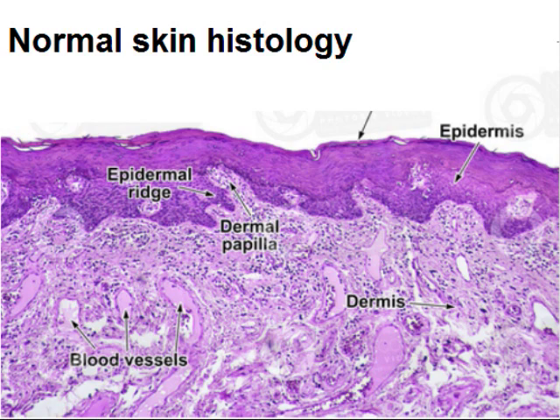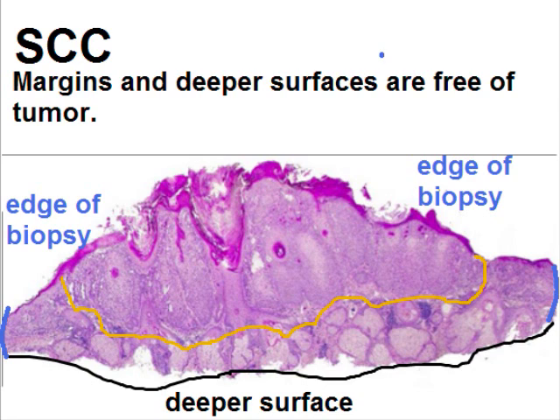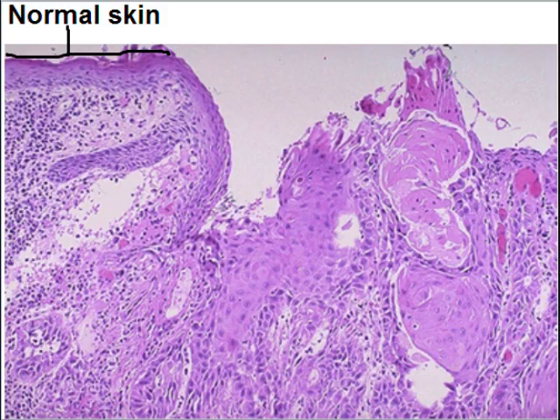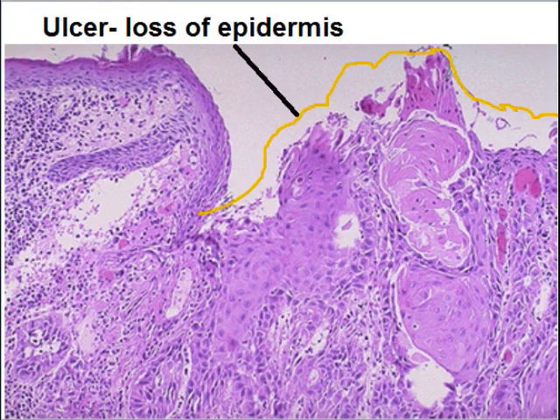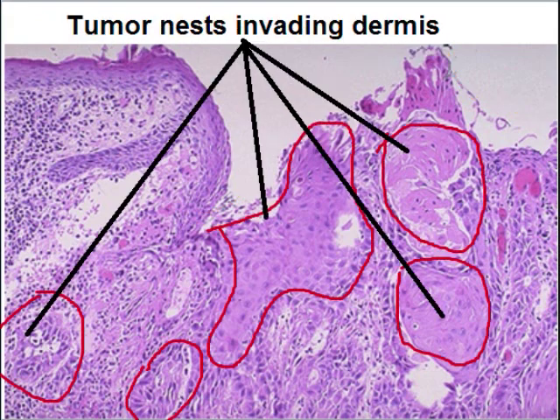The dermis contains blood vessels and connective tissue. Now in squamous cell carcinoma, you can appreciate a skin section with tumour nodules. The deeper surface is also free of tumour, and the edges of the biopsy are also free of tumour. There is an ulcer — normal skin on the left side — and here is the ulcer with loss of epidermis, and the ulcer bed shows tumourousness.